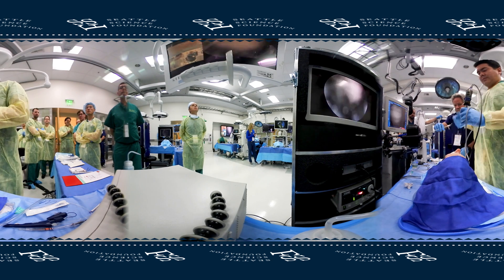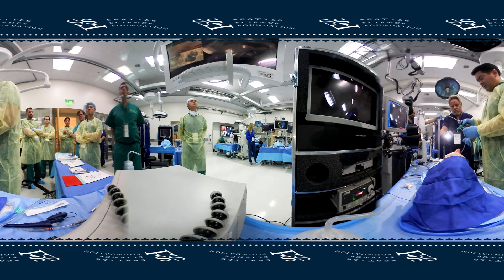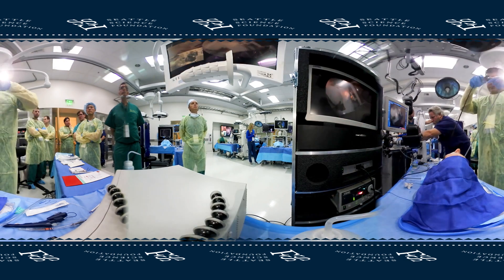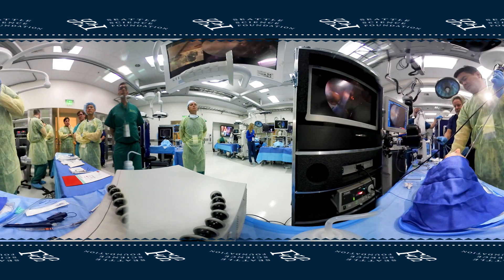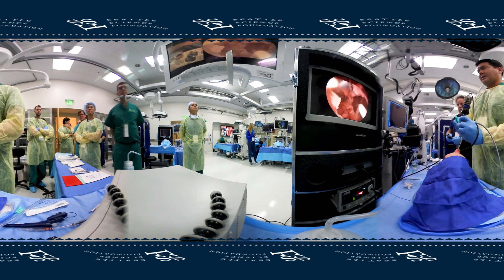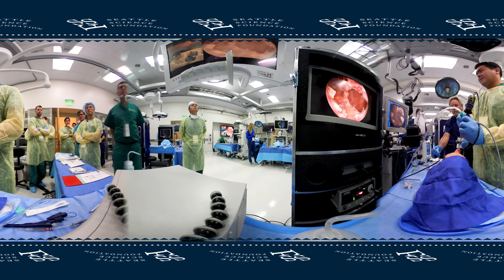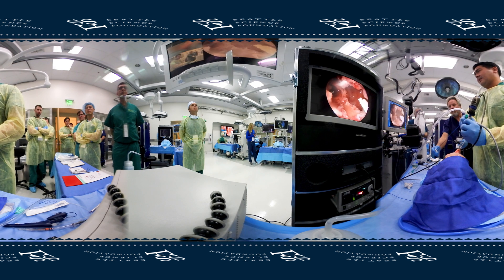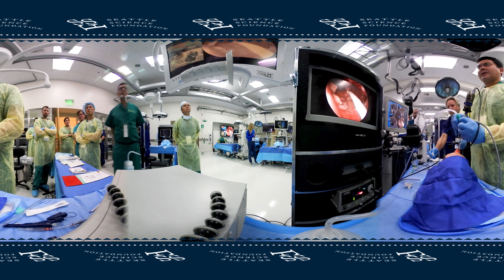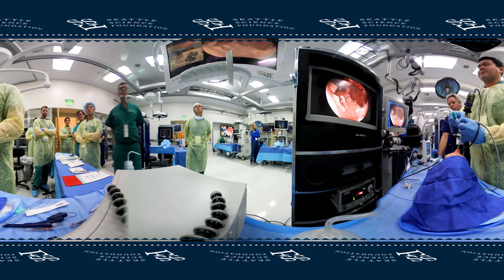That's just with a zero scope. With a 30, you should be able to see quite a bit more. With a 30 now, you can see quite a bit more of the lateral wall and almost all the way anteriorly. With a 70, you can begin to see the anterior border of the maxillary sinus. I made my cut short, but otherwise you could take this flap now and basically lay it back across so you don't have exposed bone.